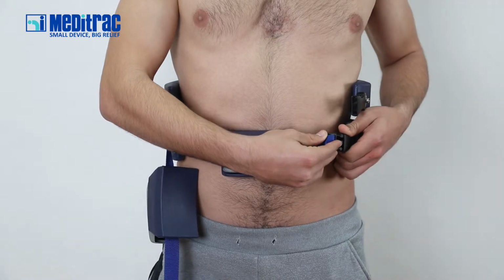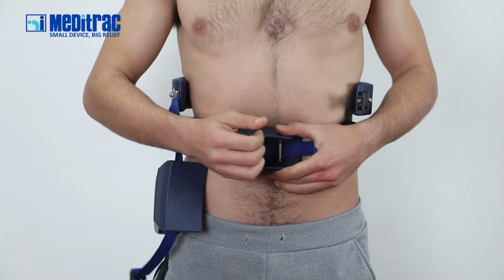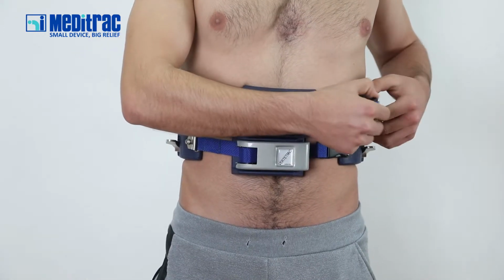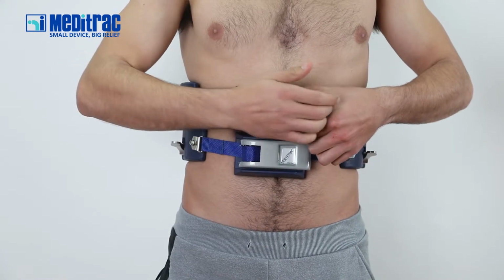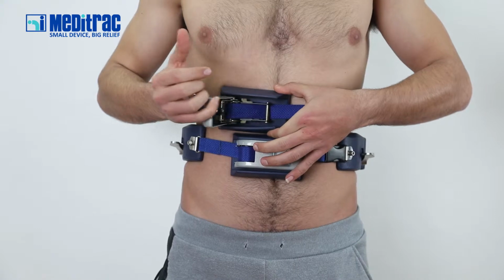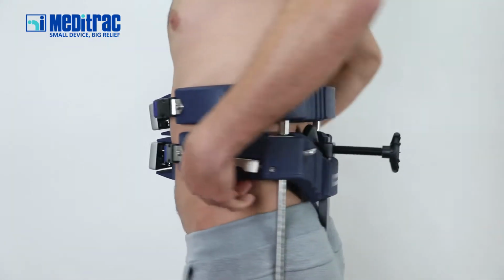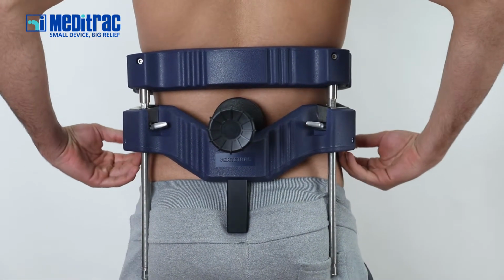The patient should be instructed in the proper and safe use of the Vertetrac. Once the patient is comfortable with the use and maintenance of the unit, the patient, according to his medical condition, may begin performing self-treatment. The patient should follow a treatment schedule outlined by the physician. Long-term patients should be examined monthly by the physician in order to gauge the patient's condition and the improvement accomplished.